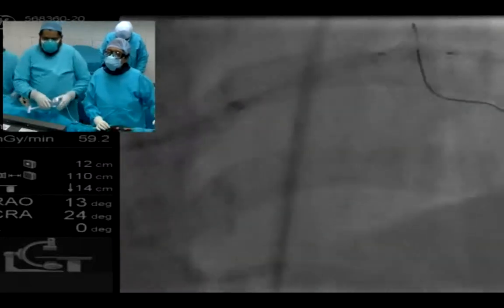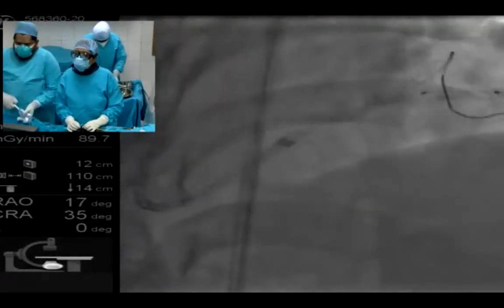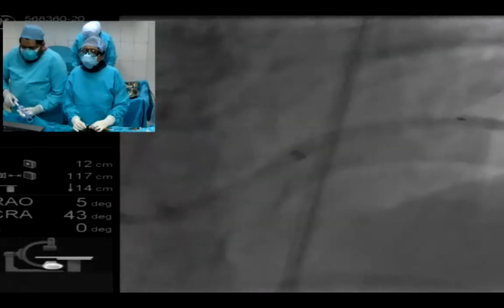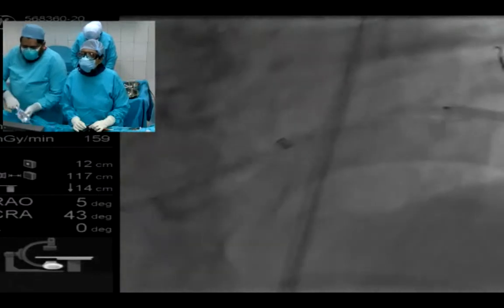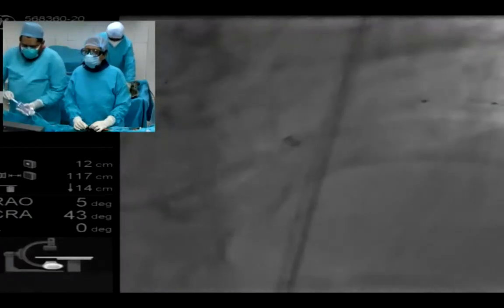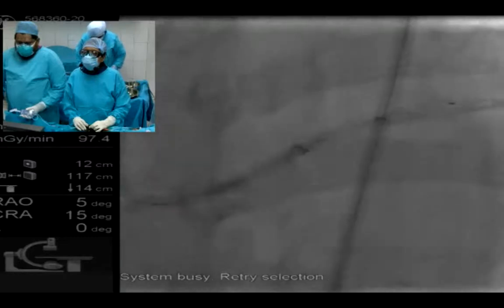As you noticed, we used a large stent for the LAD. So we're going to do post-dilatation for the entire length of the LAD now, and then we're going to do our report. So we're inside the stent. This is a 3.5 by 12 NC balloon, and we'll make sure that we dilate the entire stent, make it properly apposed to the wall of the LAD, and ensure that it doesn't fall on the junction or bifurcation.